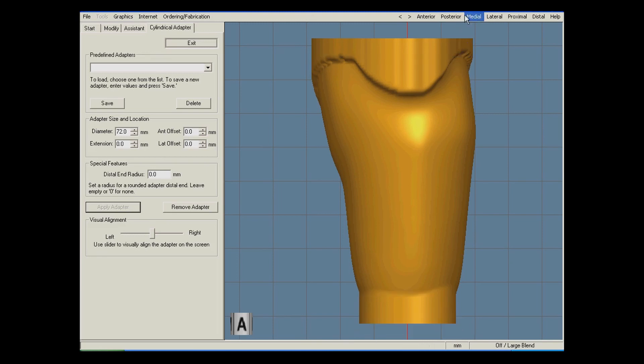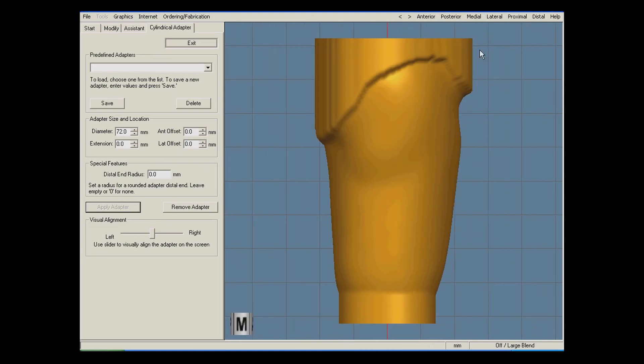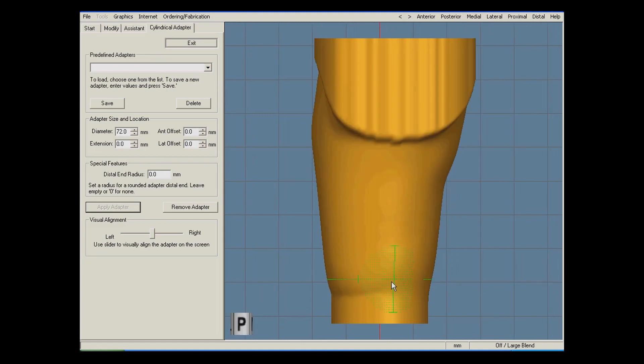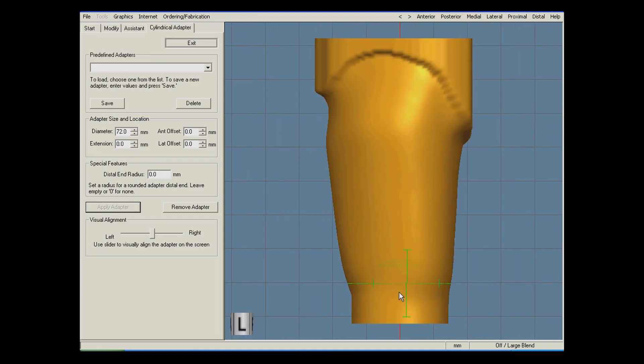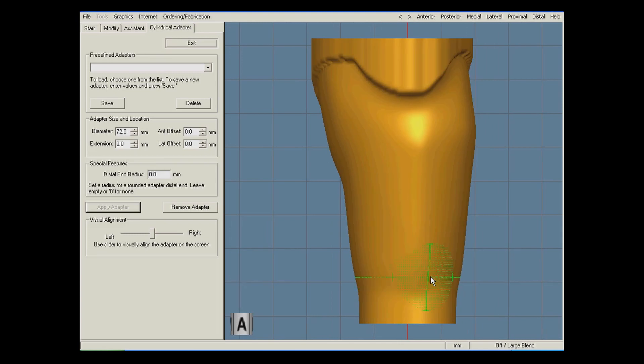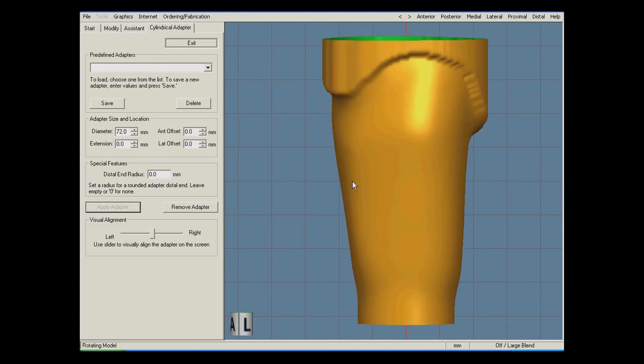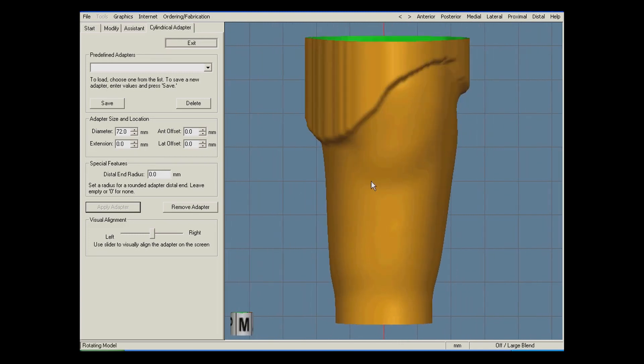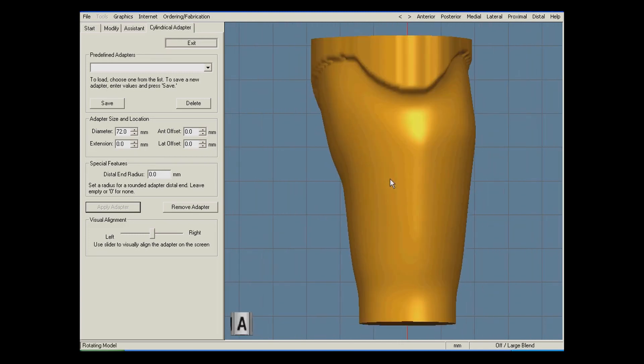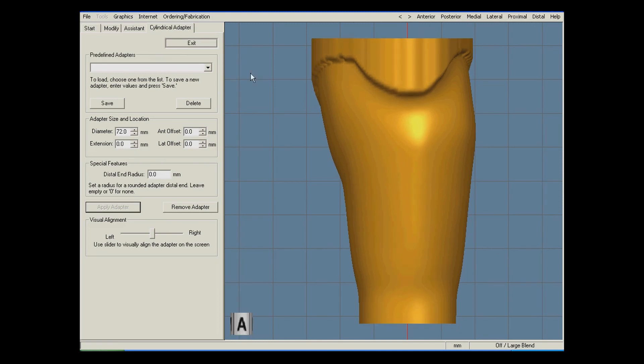Now to finish the modifications, I use the large blend tool to smooth out the connection between the adapter and the socket. This finishes all the modifications we needed, so the socket is now ready to be printed.